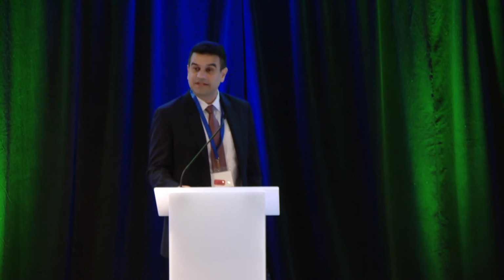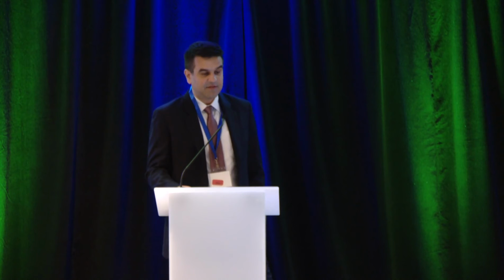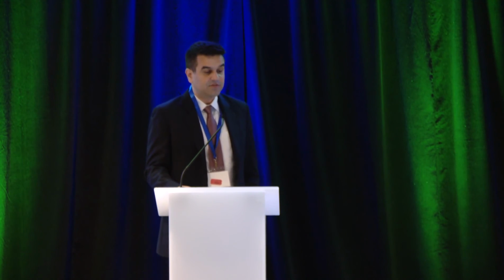And typically, an example swallow will look like the image shown, where you're really not worried about an outflow obstruction down there. A lot of this is pattern recognition when you do more of this. And you're going to have that normal IRP and not a lot of activity there in the body. You may end up with an inconclusive diagnosis if you have a borderline median IRP, particularly in the Medtronic system of 10 to 15 in at least one position. And in those cases, you're going to consider type 1 achalasia.